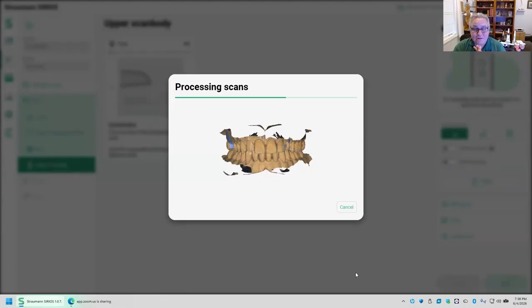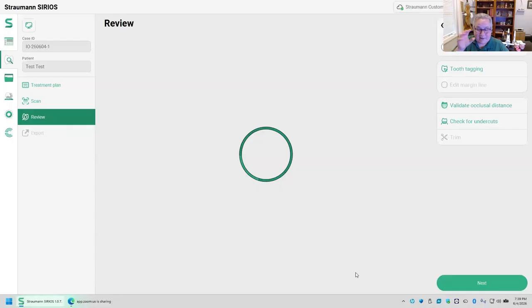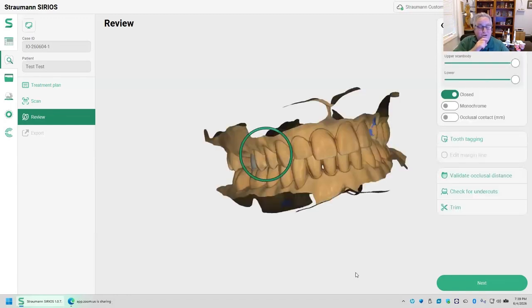I think at this point, just about any lab will accept a PLY file. We create both with every single scan you take. So you take a scan, and the software is going to create a PLY and an STL on every scan. In the preferences in the software, there's an area where you set what scan you want to send by default to your lab, okay? And the best choice today for most labs is PLY, because that sends them the mesh and the color. And a lot of times when they're looking for margins, again falling back on tooth-borne workflows, they'll toggle between color on, color off, color on, color off to find that best margin.